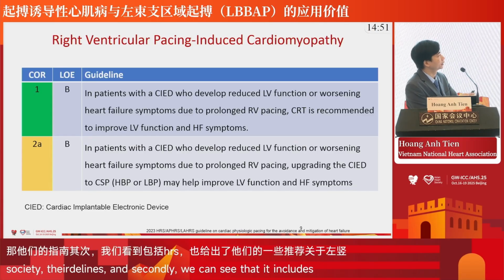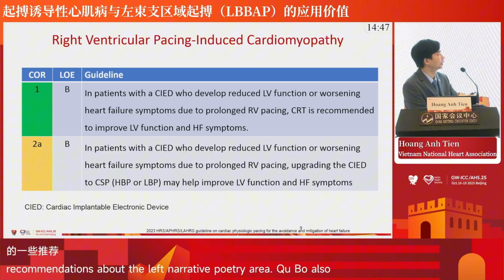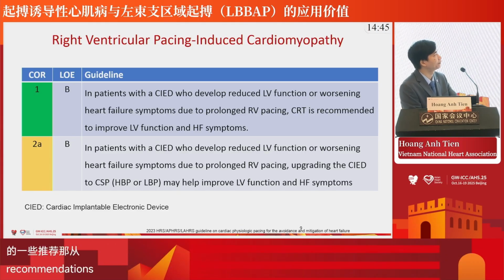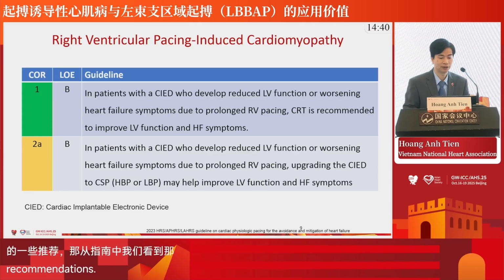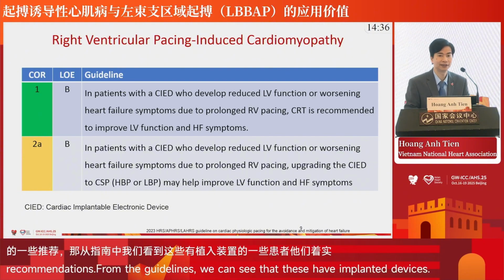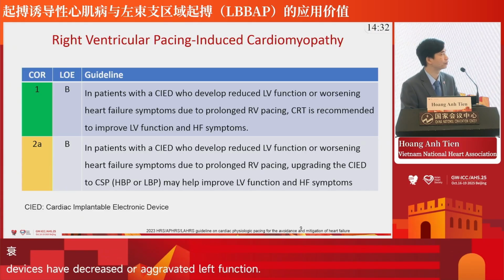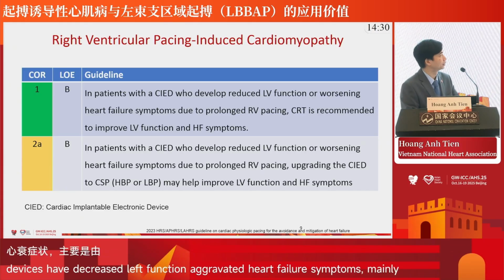The guidelines say that in patients with a cardiac implantable electronic device who develop reduced left ventricular function or worsened heart failure due to prolonged right ventricular pacing, cardiac resynchronization therapy is recommended to improve left ventricular function and heart failure symptoms.